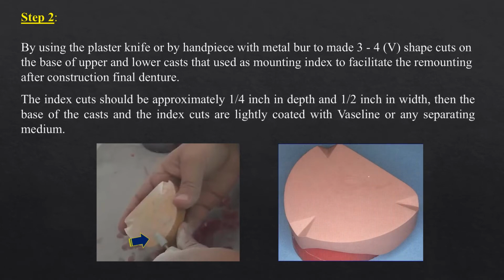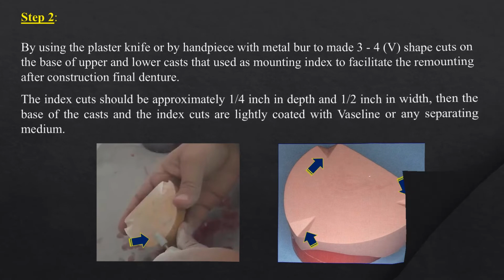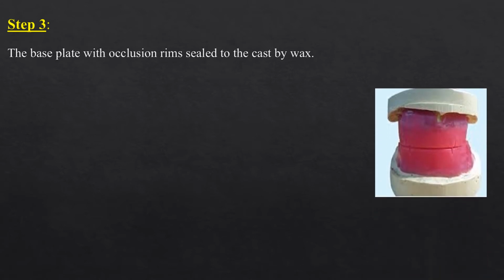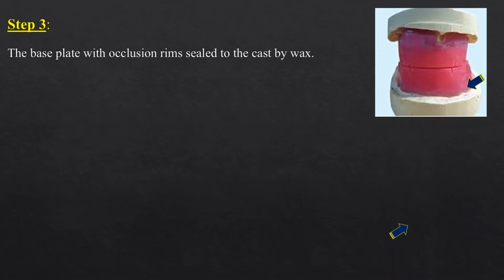The index cuts should be approximately a quarter inch in depth and half inch in width. Then the base of the casts and the index cuts are lightly coated with Vaseline or any separating medium. Step 3. The base plate with occlusion rim is sealed to the cast by wax.